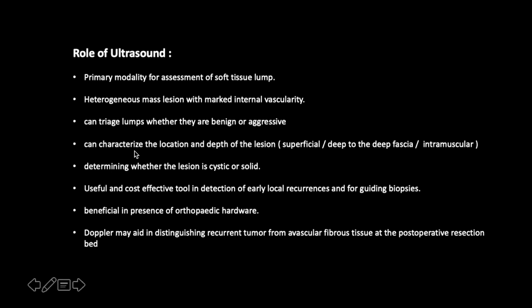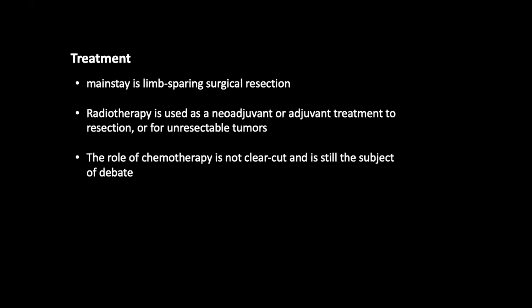And in our institute, I'm sent the patients for follow-up for post-operative status to look for any local recurrence and also for guiding biopsies. It's also helpful in cases of orthopedic hardware. Doppler can help us in this case in distinguishing a recurrent tumor from avascular fibrotic tissue of the resection bed.